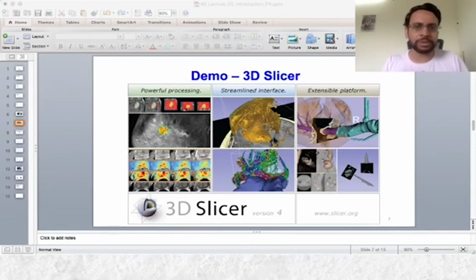That's done in C++. Somebody who would like to get a mastery over programming in medical imaging, this is a strongly recommended tool. And then again, a lot of algorithms for segmentation are also there. Let's say region growing algorithms, watershed based segmentations, level set based segmentations, and some hybrid methods as well. And another tool, maybe this is a bit more specific tool, this is referred to as the SPM tool, available in MATLAB, statistical parametric mapping. Particularly for functional MR imaging, this is widely used.